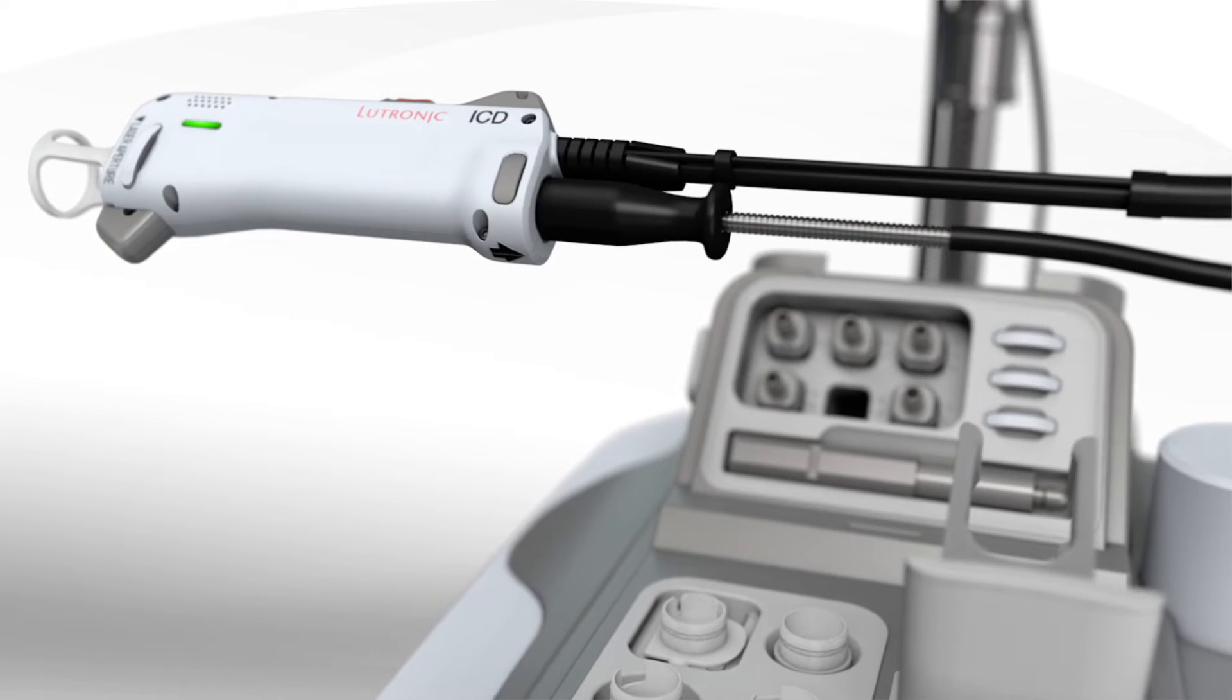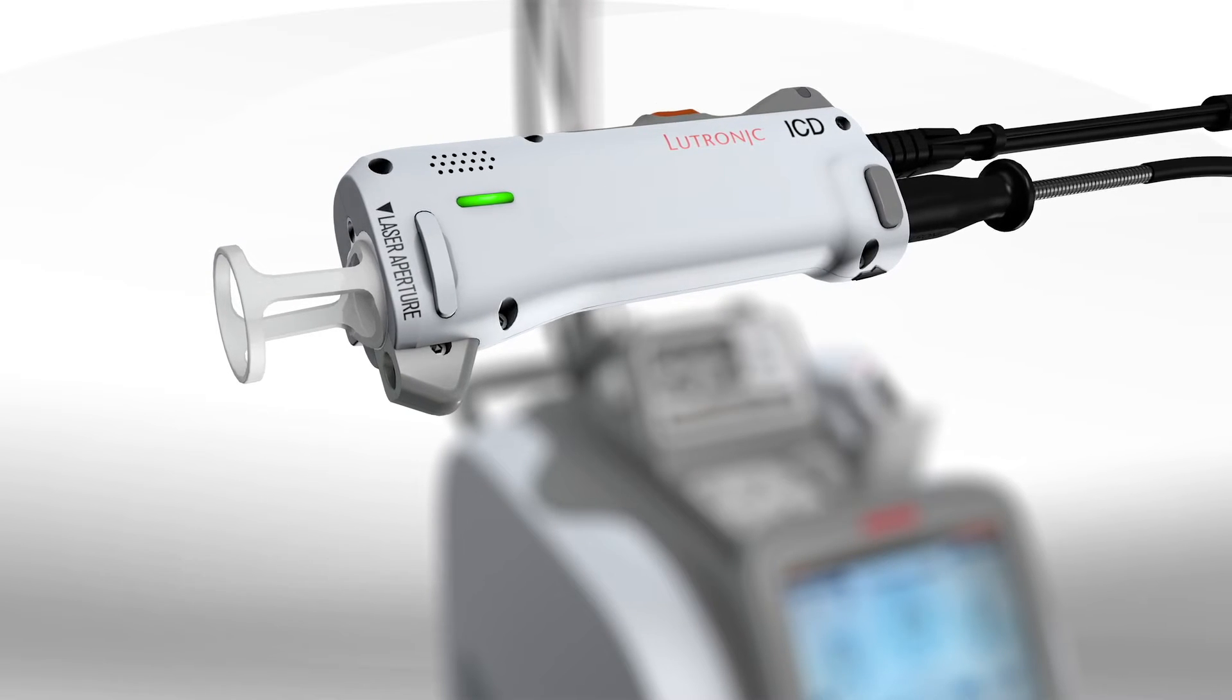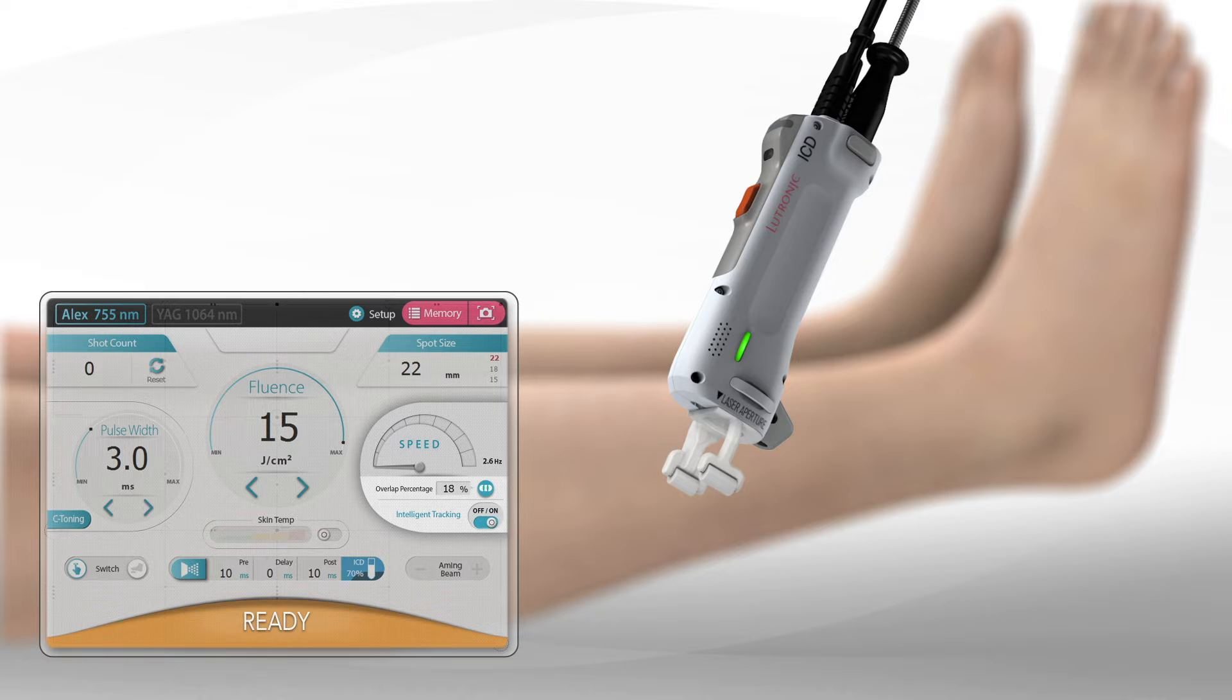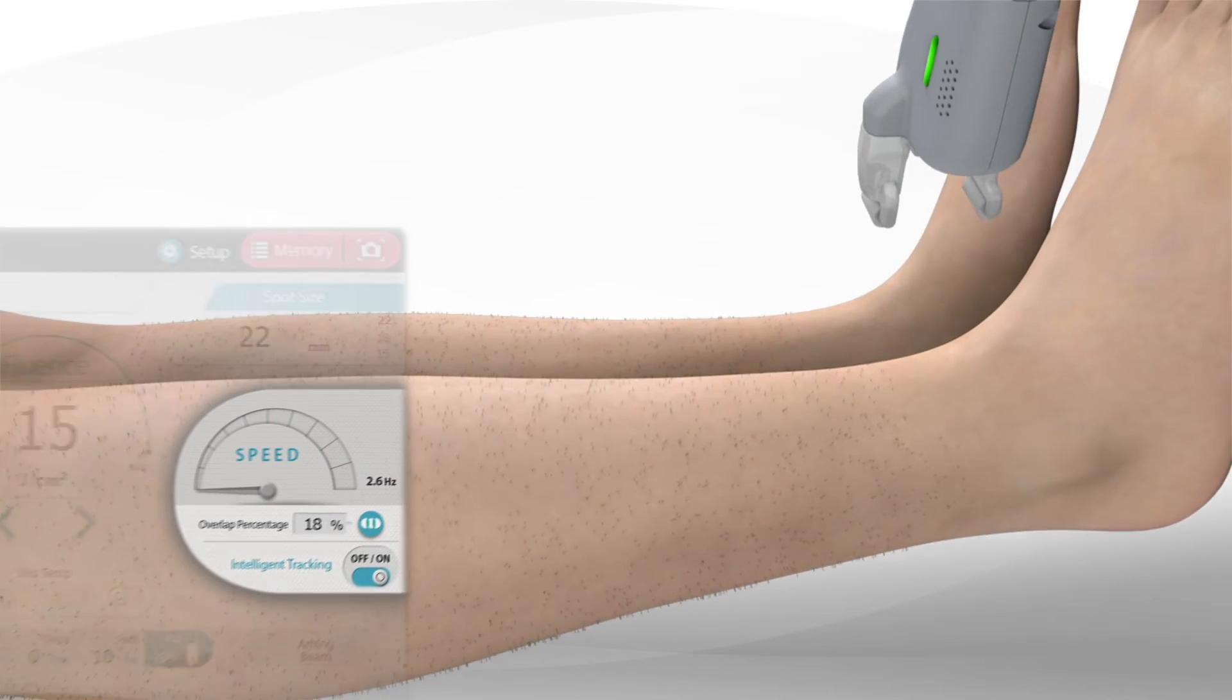Practitioners can quickly and effectively remove hair, pigment, and vascular lesions. And with its higher power, your patients get the faster, effective treatment they deserve, while your practice benefits from higher ROI.